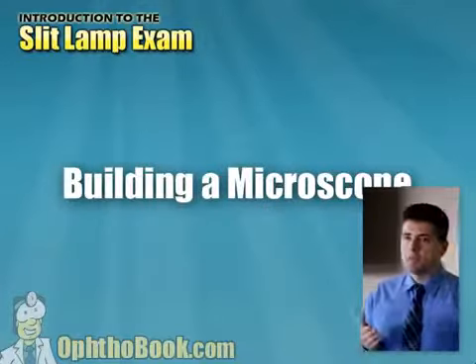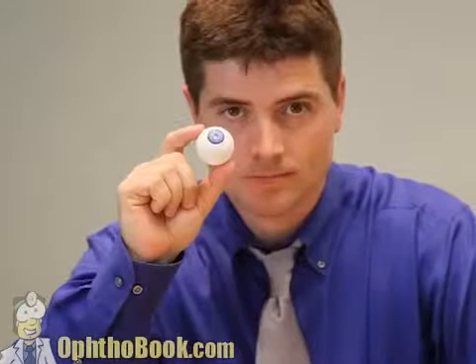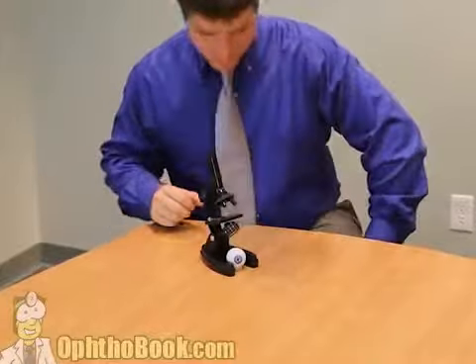And let's begin by building a microscope. Now, the eye, as we know, is a very small structure. It's about 1 inch in diameter, and in fact, the part of the eye that we look at, the anterior segment, is even smaller than that. So we really need a microscope to see what we're doing. We don't need a high-powered microscope. We're not looking at individual cells, but we certainly need one.